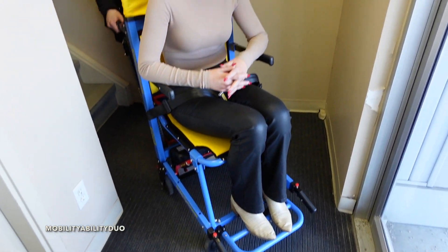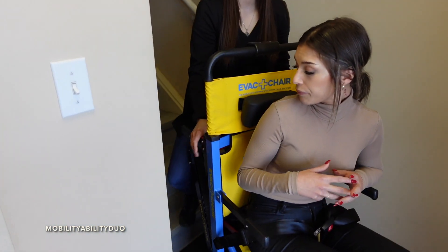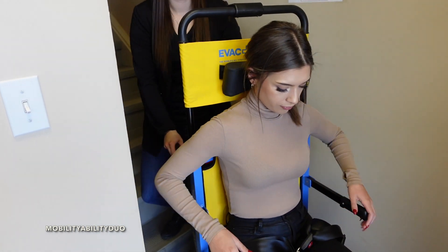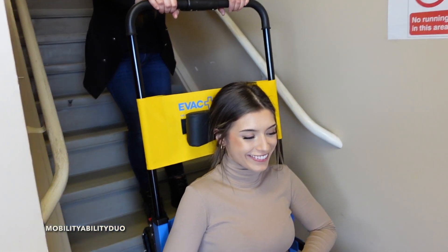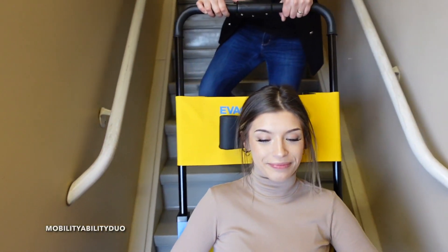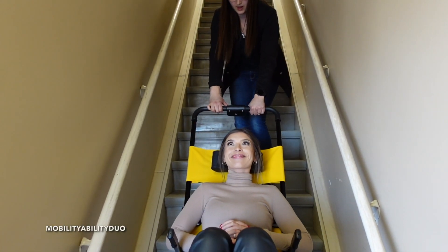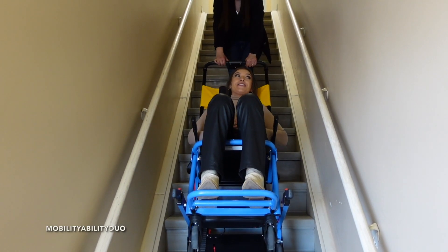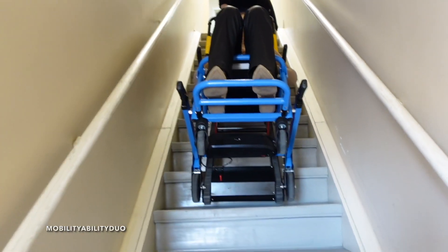You've got the footrest and you can raise the handle. So Cass and Kim - let's take it up the stairs. You tilt back and just let the machine do the work. Kim says she's in safe hands, and Cass confirms the machine is doing all the work. You can also stop it easily mid-stair. Kim says it feels very sturdy even sitting in that position. The track is going to hit all the steps, and once you get over there you keep going further back and let the machine do it, then tip you forward.